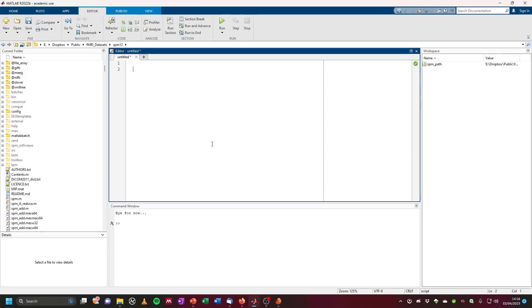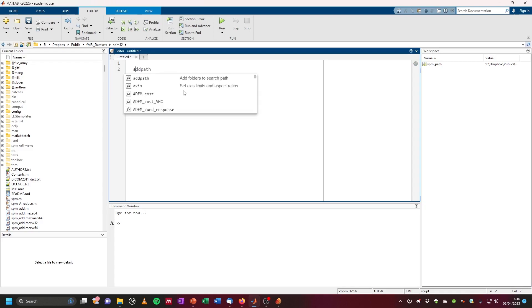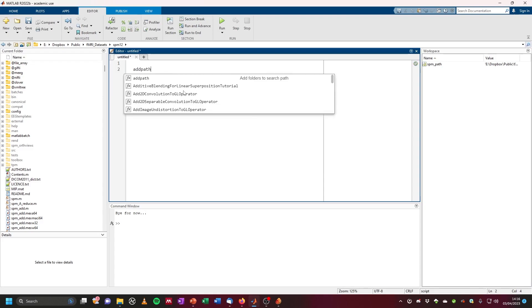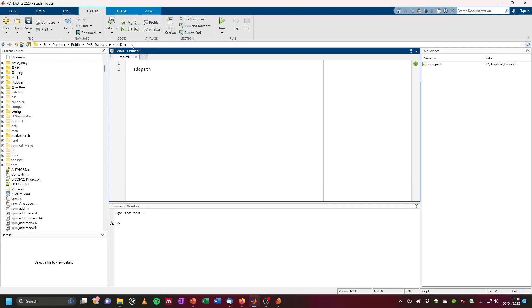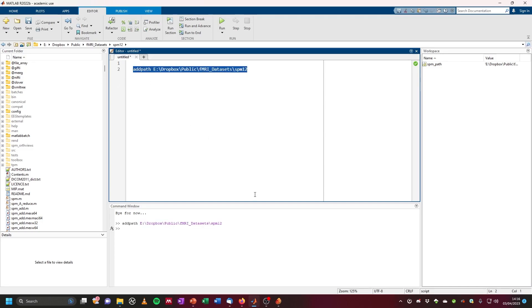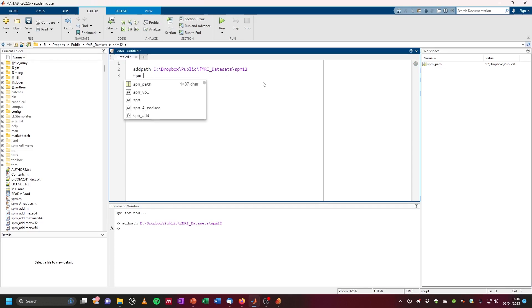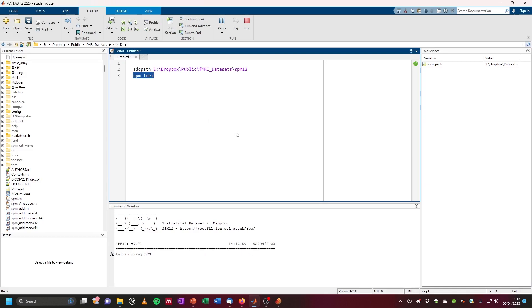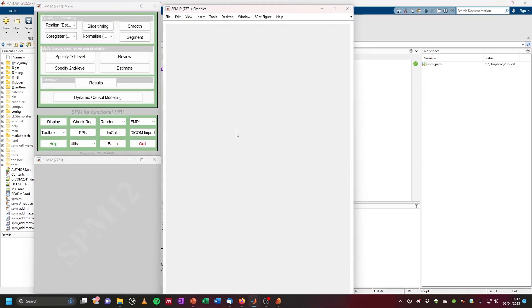Let's have a look at how to do this in MATLAB using SPM 12 with the SPM GUI. First, we have to add SPM to MATLAB using addpath, and then add the path of where SPM 12 is located on your computer. Now we can run SPM 12 by typing SPM FMRI, which will start the FMRI package of SPM.